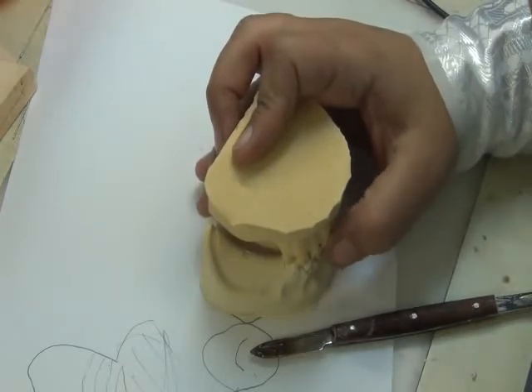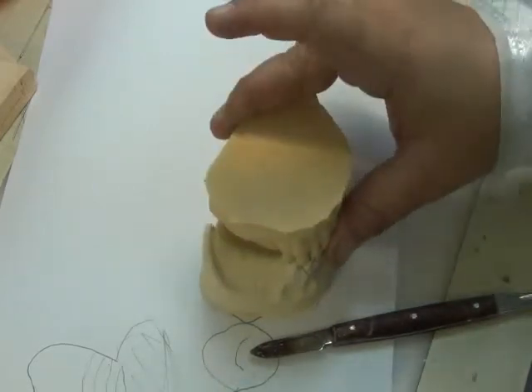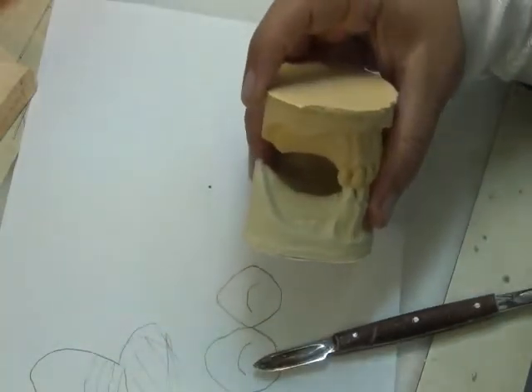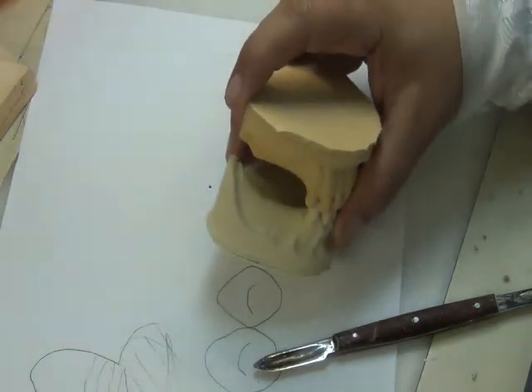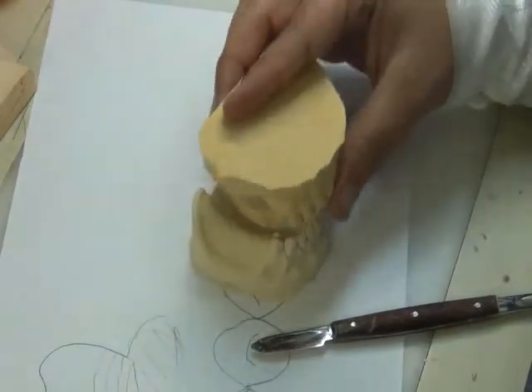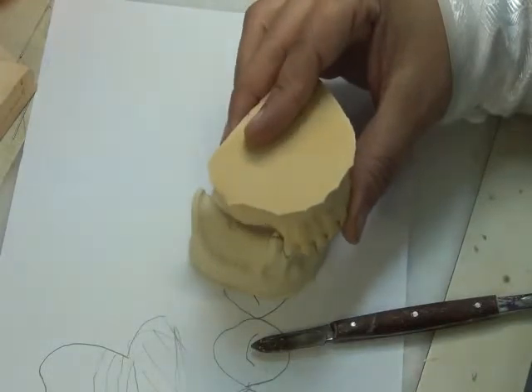I simply ask the patient to close in maximum intercuspation. And what we did here, I repeat on the other side, which is Fox plane registration of the upper, parallel with the lines of the face, the external lines in the face, and then do the lower on them. Okay. But what if we don't have enough occlusion on the anterior teeth? I go back and register in RCP.